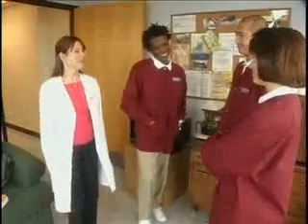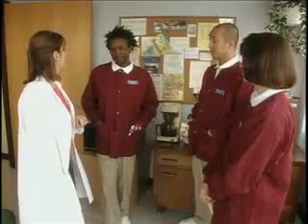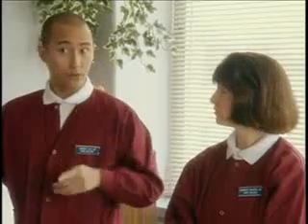I know, right? Good morning, everyone. How are you? Hi. Today, I'd like to focus on monitoring IV sites and infusion rates. Now, when do we check this? At the beginning of the shift, as part of the initial assessment. And periodic intervals throughout the day. Right. Another nursing responsibility is to monitor the IV insertion sites for possible complications as well. Now that you do every hour.